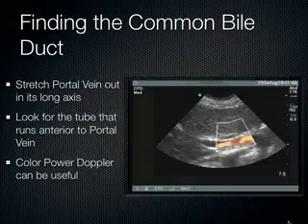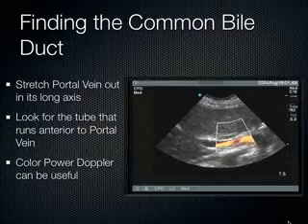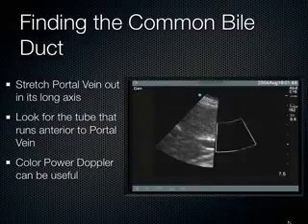Even when the gallbladder is contracting, the bile doesn't get picked up by the Doppler. It's more like little molecules and stuff, and I don't know what you call them, chylomicrons or something, I can't remember anymore.